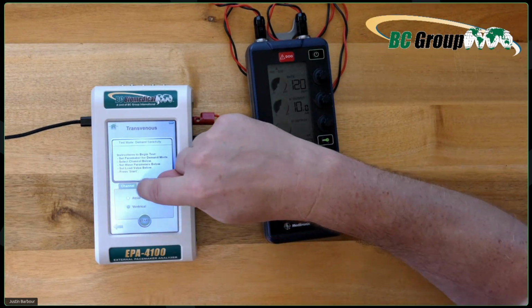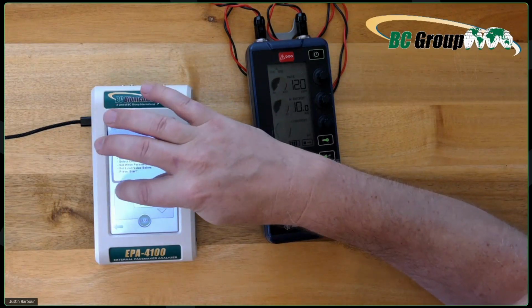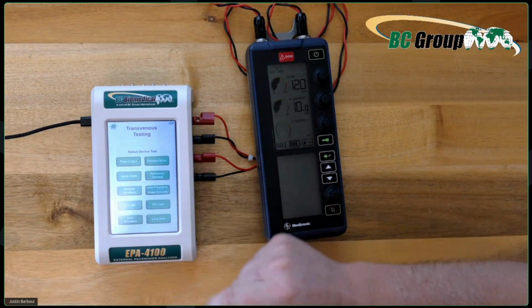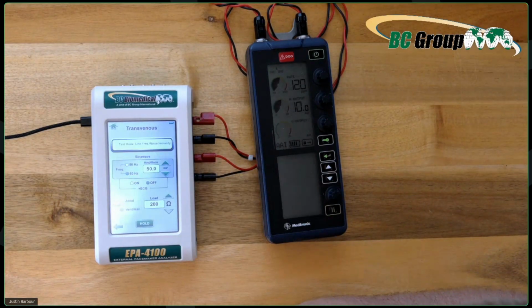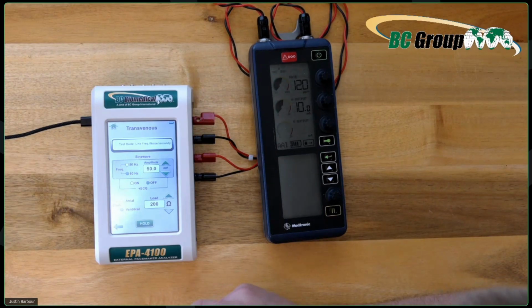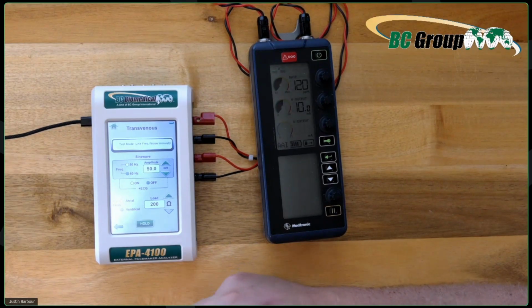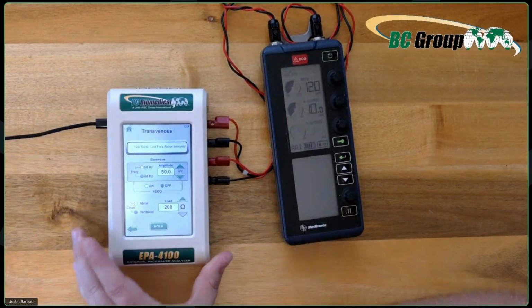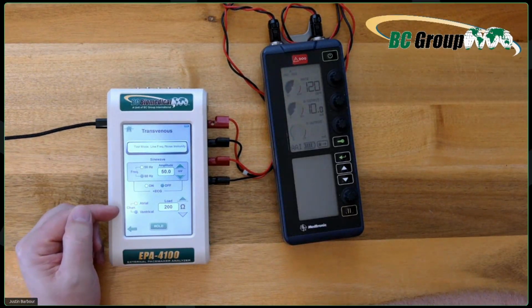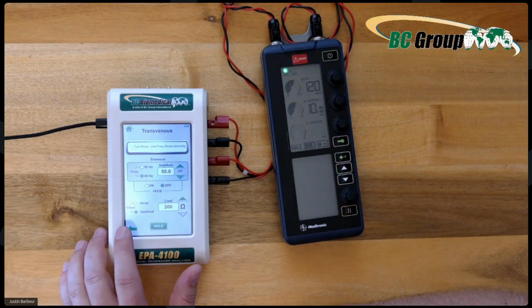We have submenus down here for each of these. There are different conditions you can test for. Then you hit start, and it measures what it's receiving. We have line frequency. So here in the United States, we have 60 hertz, and we can actually adjust the amplitude. That's kind of cool. And we can also test for the ECG for its sensitivity. And down here, we can select between atrial and ventricle and also adjust the load.